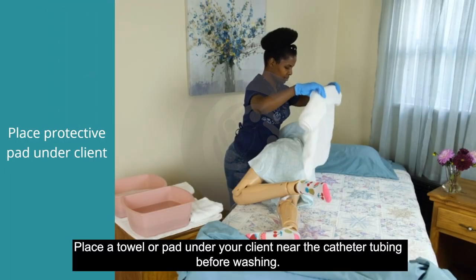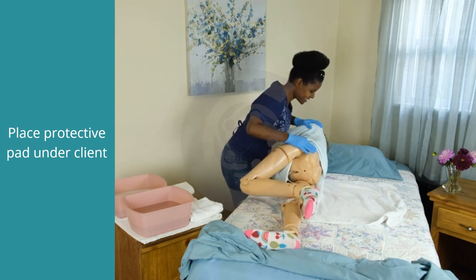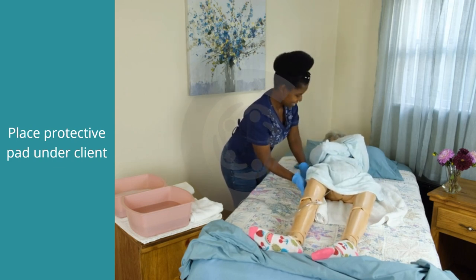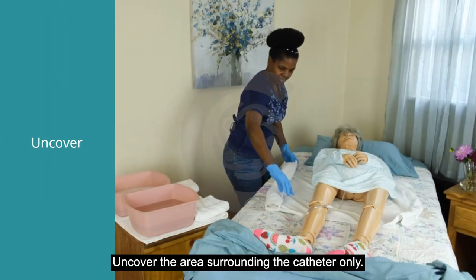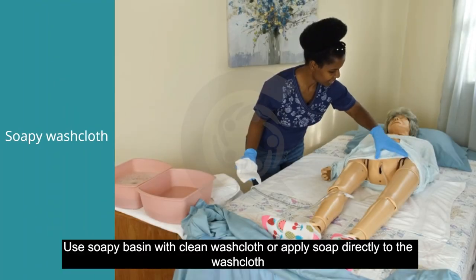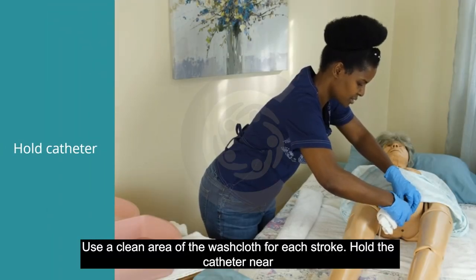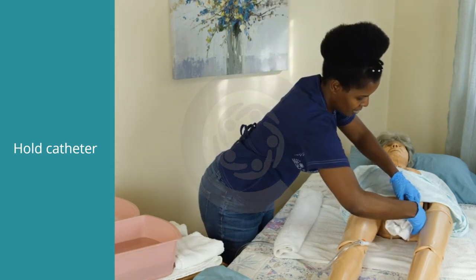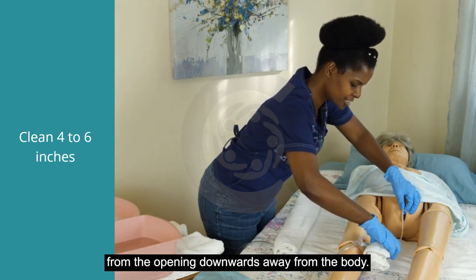Place a towel or pad under your client near the catheter tubing before washing. This prevents your client's sheets or clothing from getting wet during cleaning. Uncover the area surrounding the catheter only. Use a soapy washcloth or apply soap directly to the washcloth to cleanse the catheter. Use a clean area of the washcloth for each stroke. Hold the catheter near the opening where it enters the body to avoid tugging it — do not tug the catheter. Clean at least 4 inches of the catheter nearest the opening of the urethra, moving from the opening downwards away from the body.